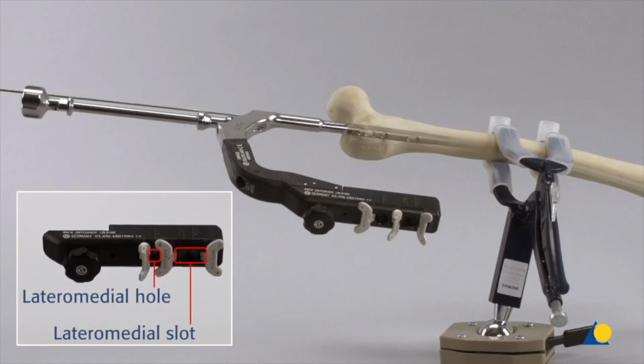The lateromedial hole and lateromedial slot are used for proximal locking. The static locking option corresponds to the lower position of the lateromedial slot. The dynamic locking option corresponds to the upper position of the lateromedial slot to allow dynamization of the bone fragments.